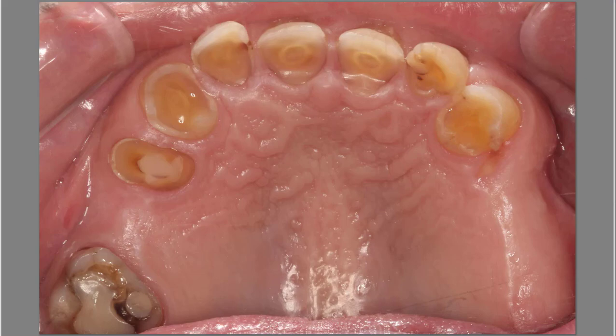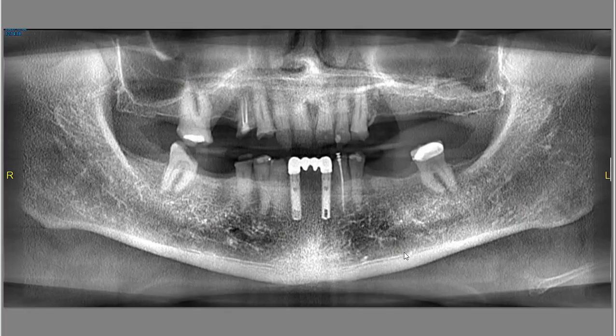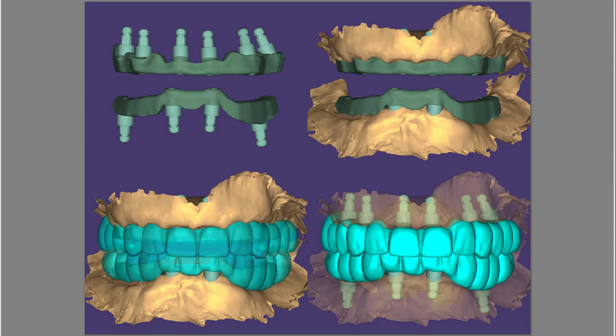There is extensive wear on the upper arch. Just appreciate the panorex pre-op — these are the old implants. We're going to place six implants on top and two implants on the bottom. After we've placed the implants, you can see the multi-unit abutments. You can see how they're supra-crestal — higher than the crest of the soft tissue — and that was the only option available with those multi-unit abutments.